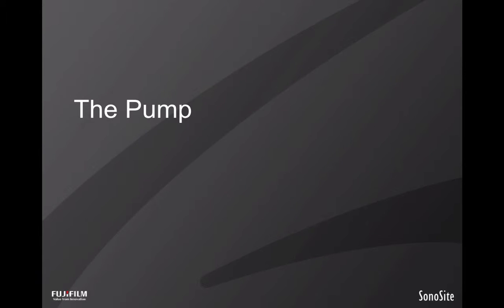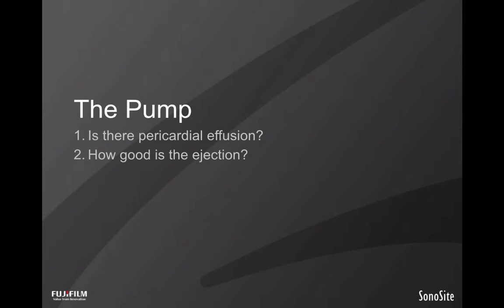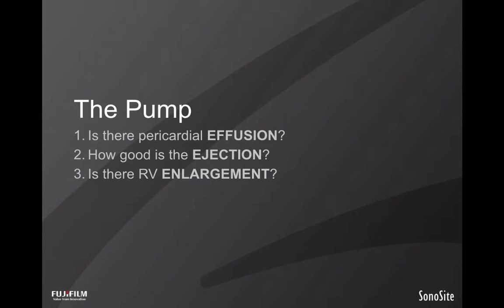When assessing the pump, we ask ourselves 3 specific questions. Is there pericardial effusion? How good is the ejection? And is there right ventricular enlargement? These 3 questions can be remembered easily as the 3 E's: effusion, ejection, and enlargement.